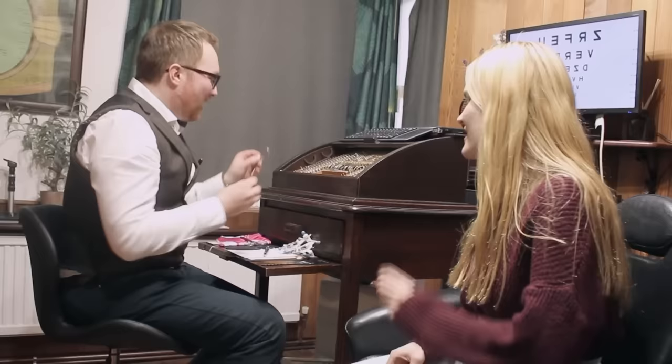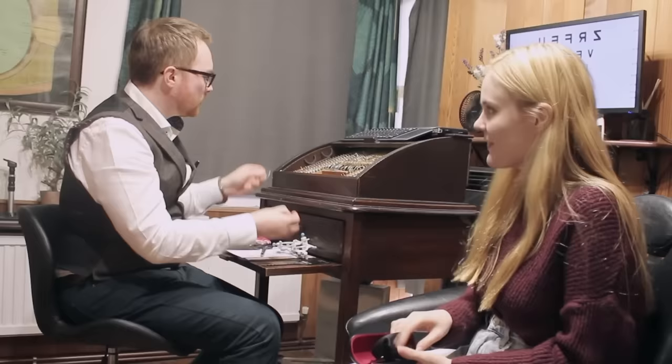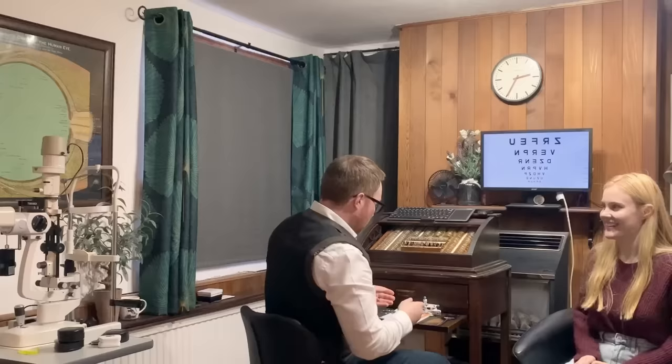So what we're going to do next is have a look at your eye health. We'll start off by getting some images of your eyes, and then I can have a look at your eyes on the microscope. And then the final thing we'll do is the machine just over there, the peripheral vision test. We've just been looking at your straight ahead vision, so we need to see how your surrounding vision is as well. Once we've got all that done, you'll have had the full MOT and we should be good to go. So I'll bring the instruments around and we'll get some images.